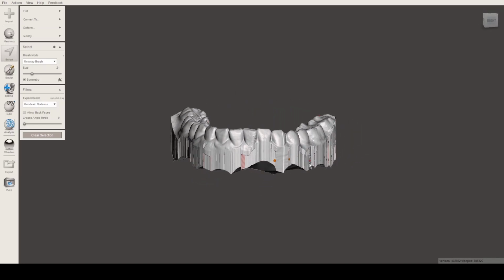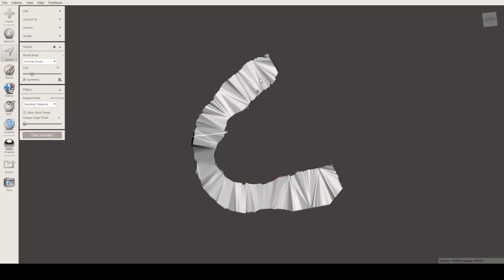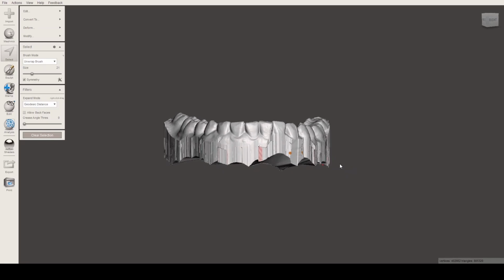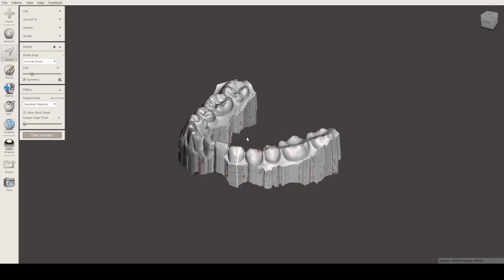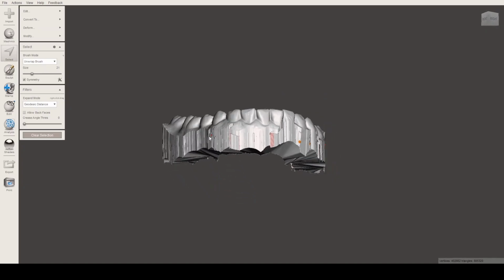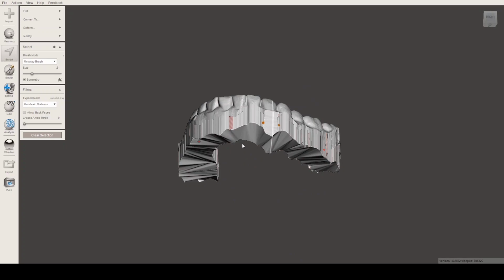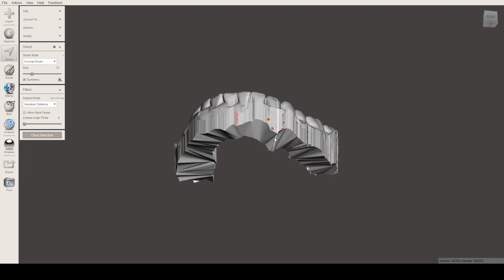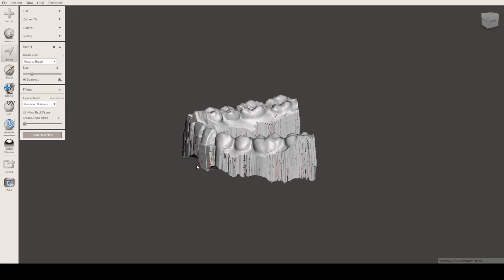Oh, yeah, I'm gonna make you divide it into four parts. So divide this model into four parts, and after that combine it. Once you combine it, I want you to extrude it. Select the bottom part and add a layer to it. So the same thing as I did in this video, but I didn't. As you can see, I had technical difficulties earlier. But divide this into four parts, so it will be like one, two, three, four, and then combine it. After you combine it, you're gonna add a layer at the bottom to extrude it. You should combine it at least two times, but I suggest four.